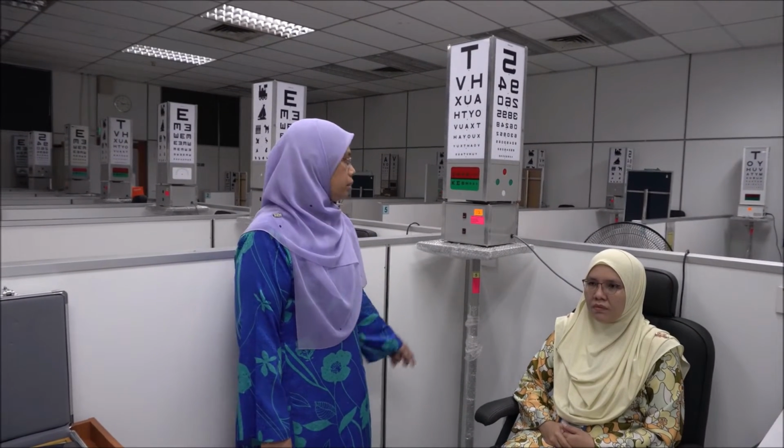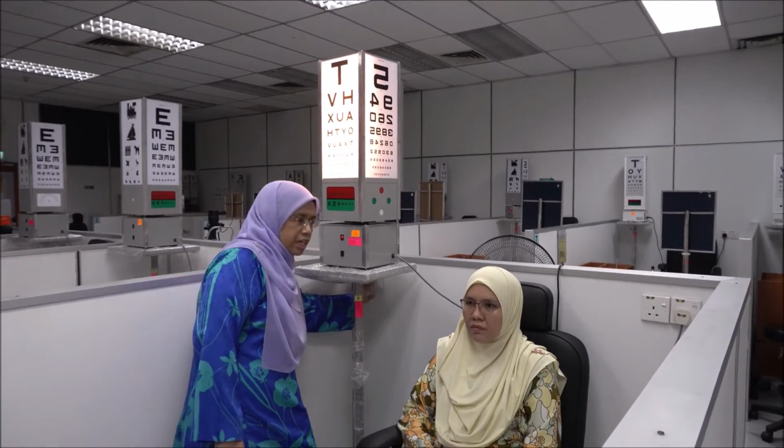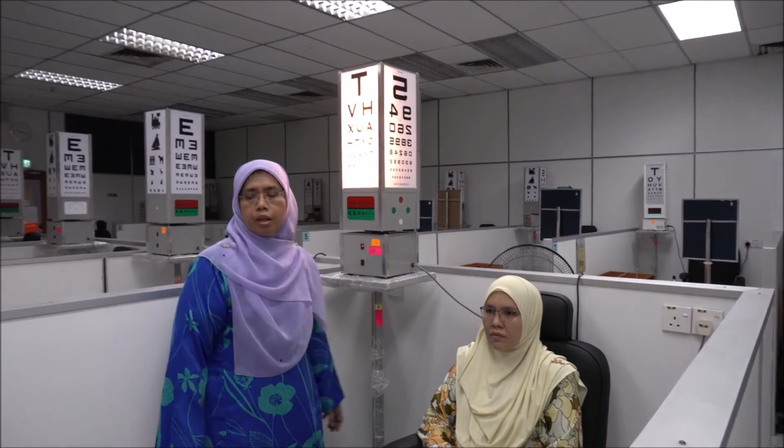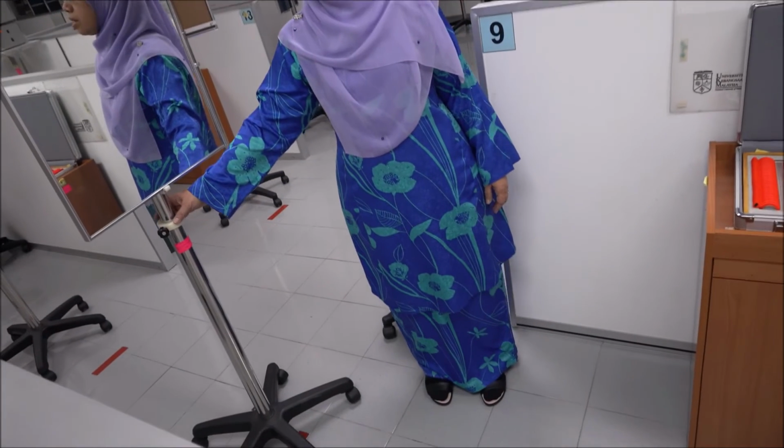Now I'm going to explain the procedure for the second lab, which is looking at the association between refractive error and visual acuity. Before we begin, we need to switch on the lights for the Snellen chart as well as the lights for the cubicle. And also please ensure that the mirror is located at 3 meters in front of the subject.